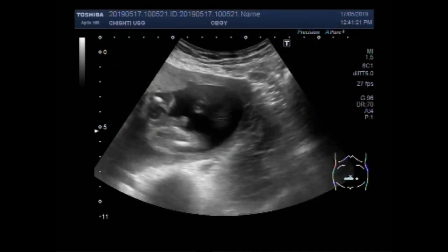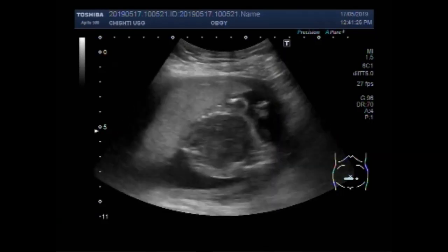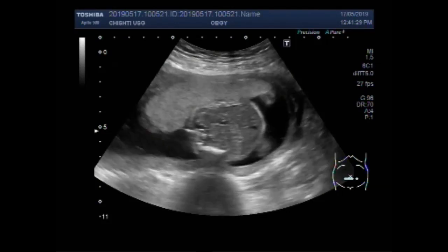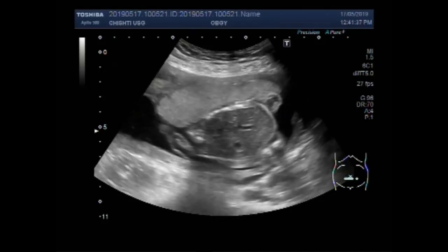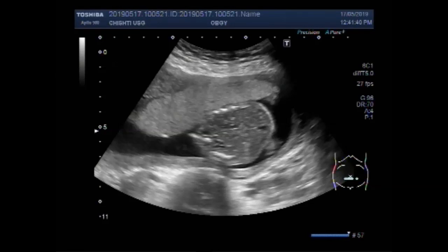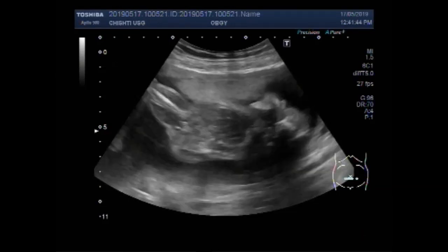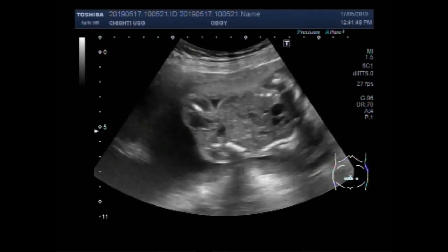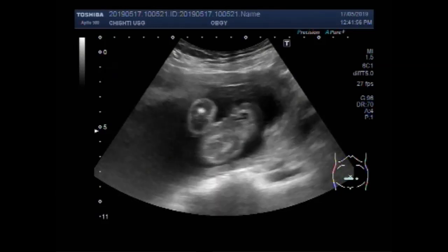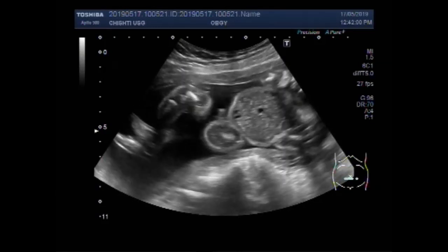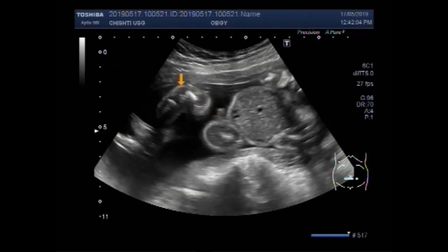You can see there is a male fetus. Abdomen of the fetus. Legs are also visible. This is the knee joint. This is the foot of the fetus.